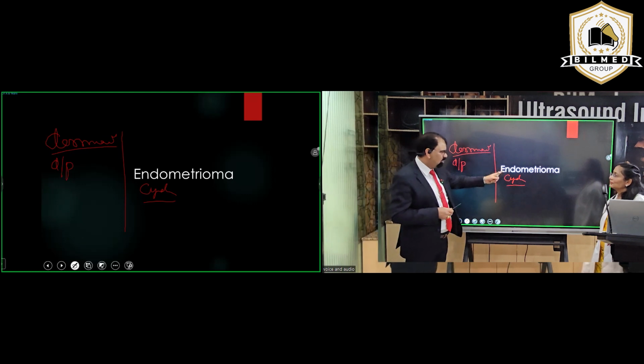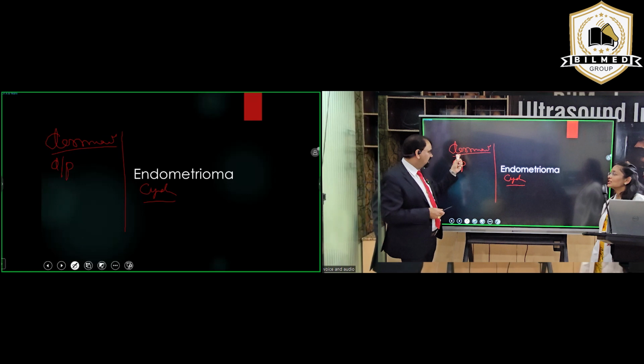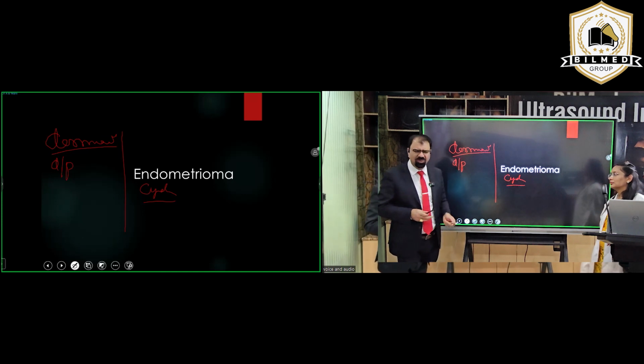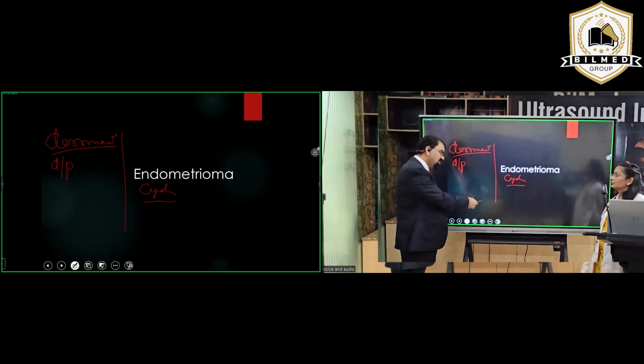Now, in endometrioma, when you are putting a color box, will it take color? Yes or no? Yes, possibilities. But dermoids? No, because dermoids are calcified and avascular. So this way you can differentiate this dermoid from an endometrioma. So this was a brief of a differentiation. On our server we are having more than 2 classes on the differentiation only.